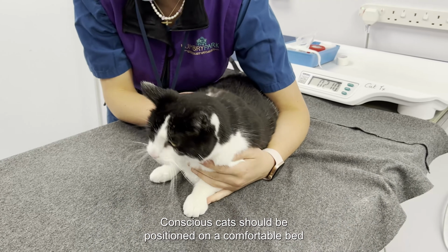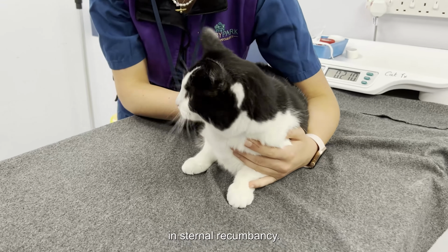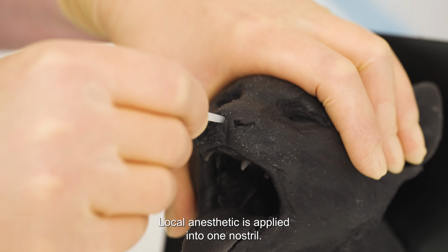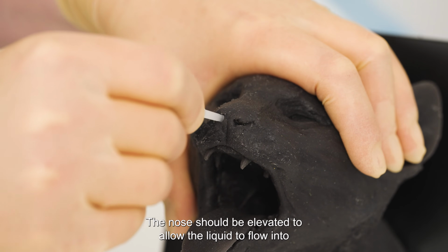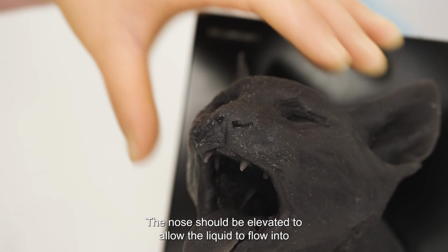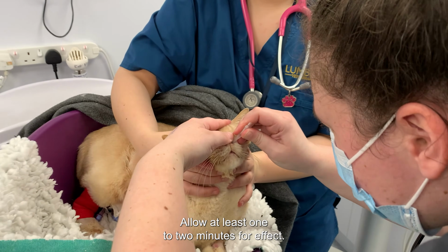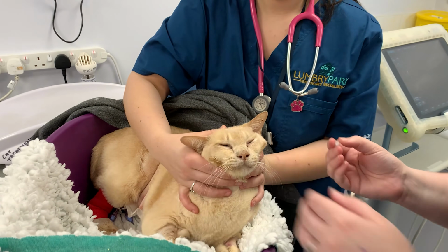Conscious cats should be positioned on a comfortable bed in sternal recumbency. Local anaesthetic is applied into one nostril. The nose should be elevated to allow the liquid to flow into the caudal nasal cavity. Allow at least 1 to 2 minutes for effect.